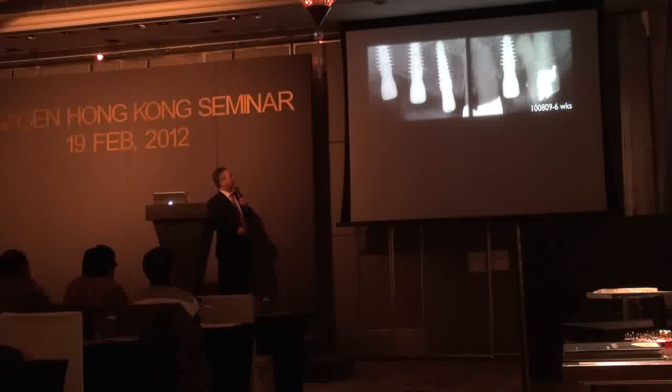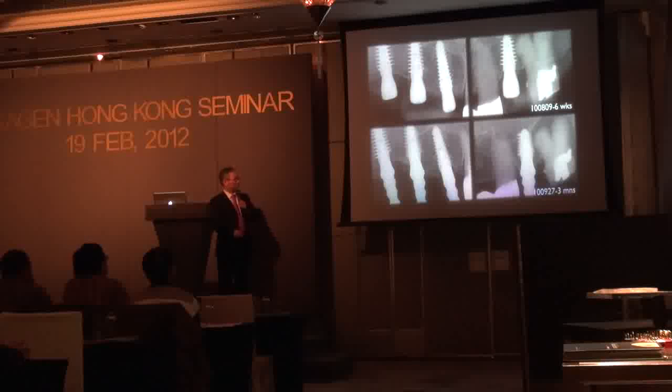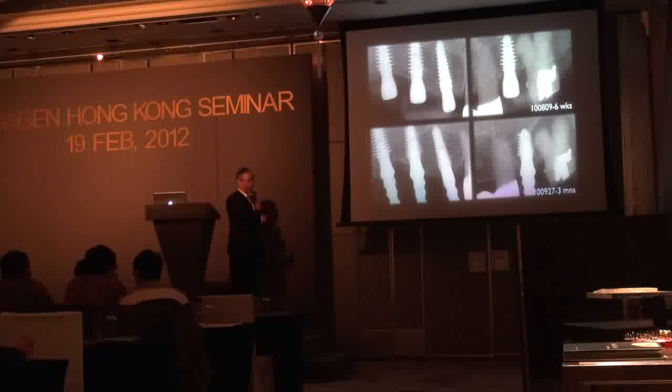And 6 weeks later, 3 months later, I took an impression. See how much bone it has. Comparing with this implant, it has much more bone content. Actually, the actual bone content will be almost similar to this because it has dense bone, while this area has loose bone.